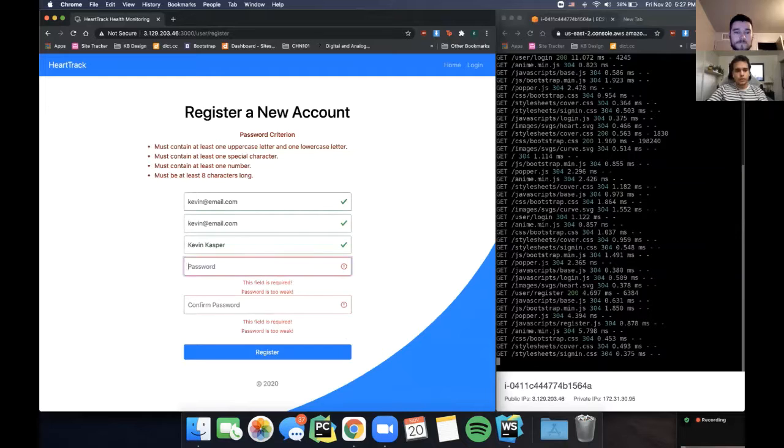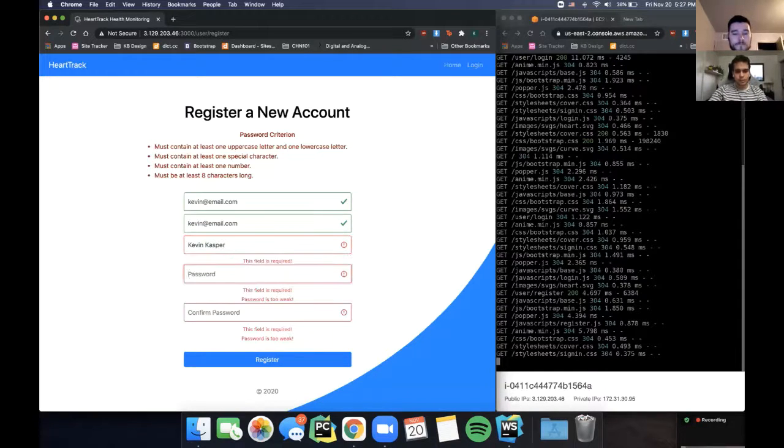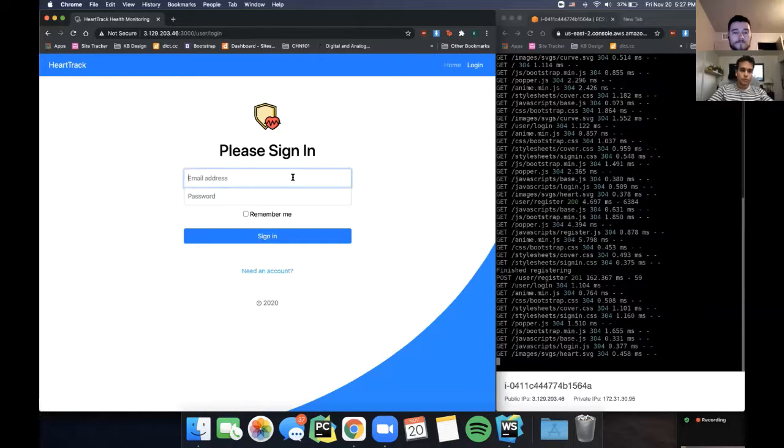And if you try and create a password that is too weak, or if you have a field that is empty, you will get some nice error feedback thrown at you. So we're going to go ahead and create a password that's strong. After successful creation, we'll be redirected to the login page, where we can just use that new account.